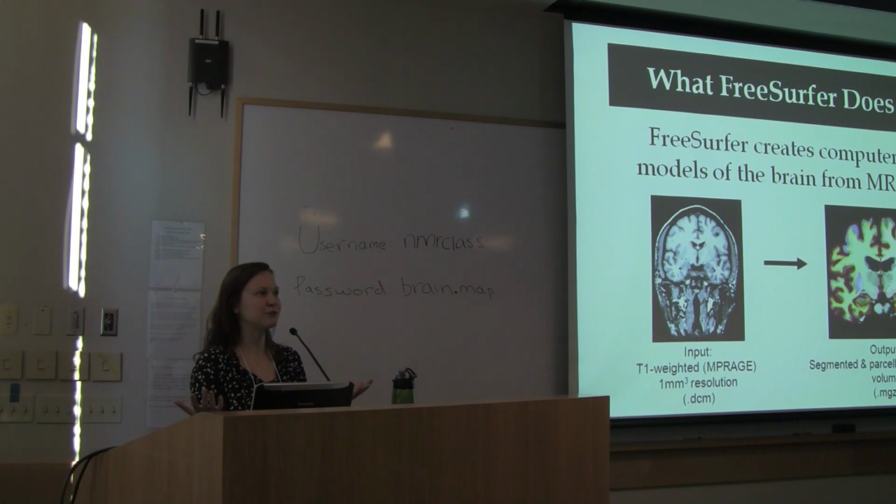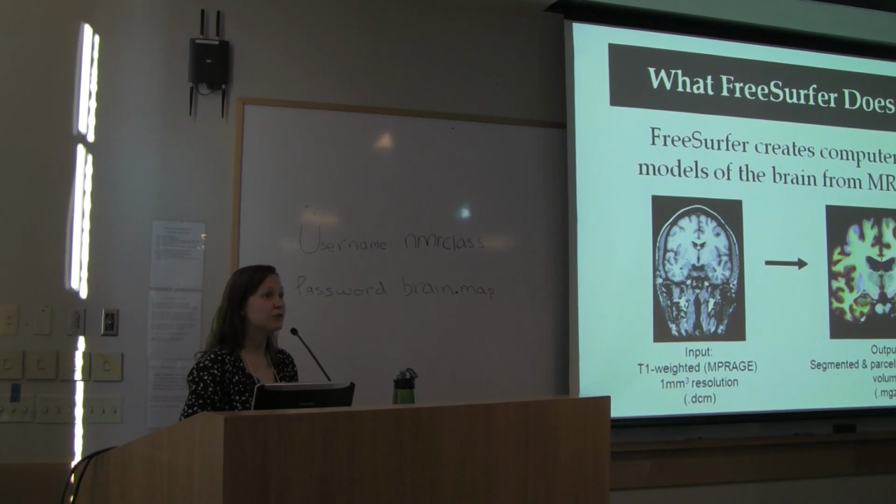you are all here to learn about FreeSurfer, so you may know this already, but what FreeSurfer is really doing is taking your MP-Rage, or your T1 weighted image, and it's labeling all the different parts, and doing this automatically without much work from you other than you sending a command and saying, do this. And it takes some time, but it definitely doesn't take as long as it would if you did this by hand. So it's great that FreeSurfer goes and does all this, and it labels gray matter, white matter, subcortical structures, different cortical regions, everything for you, and computes the stats for every subject you give it.